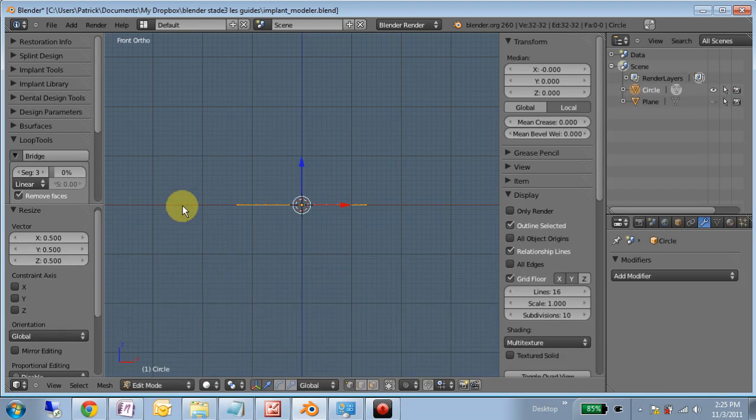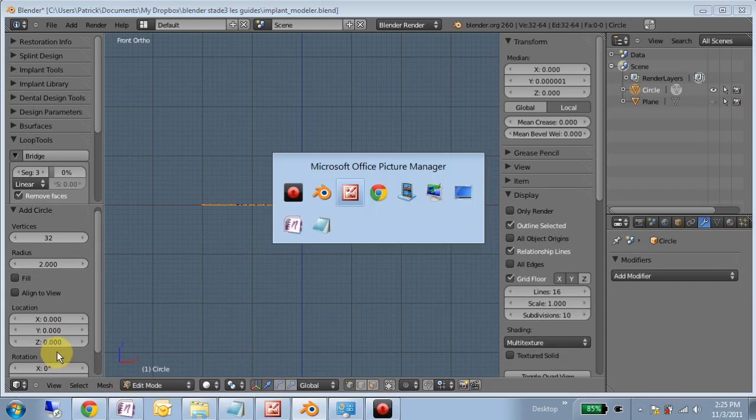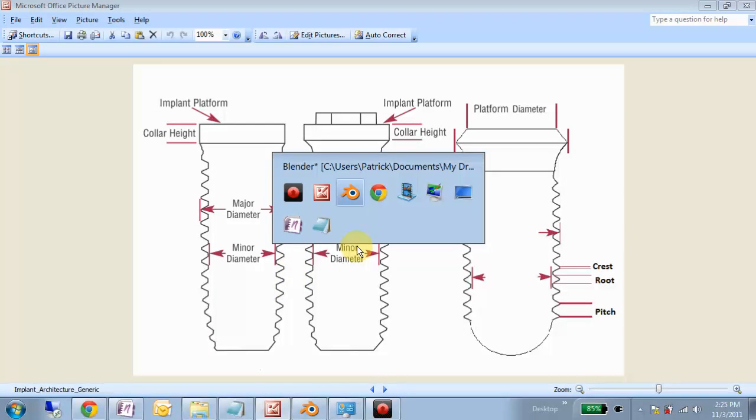Now that's because when you add a circle, it gives you a radius of 1, not a diameter of 1. But all of our dimensions are in diameter. So I'm going to add another circle. Again, a radius of 1. So you can change this here, or you can scale it later. So just to show, I'll give this a radius of 2, or diameter of 4, which you may remember is our major diameter for this particular implant.